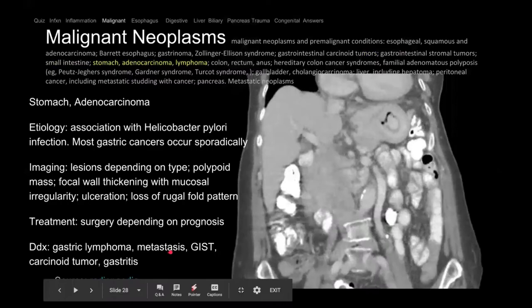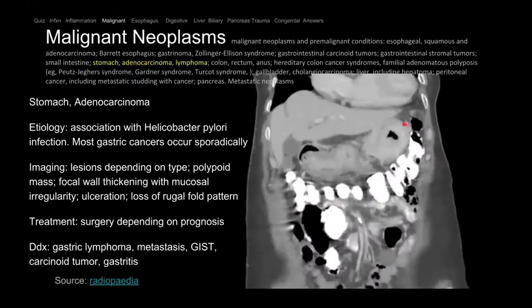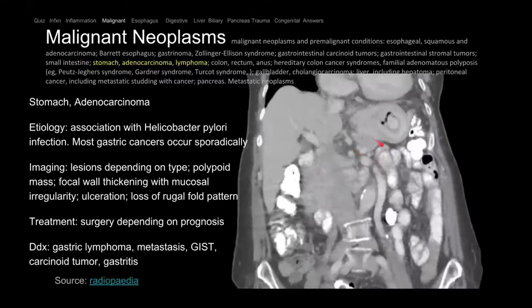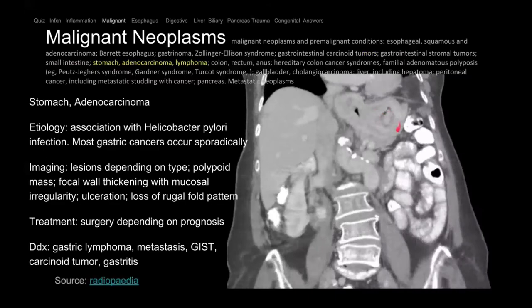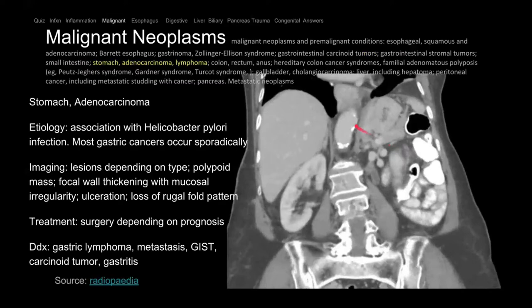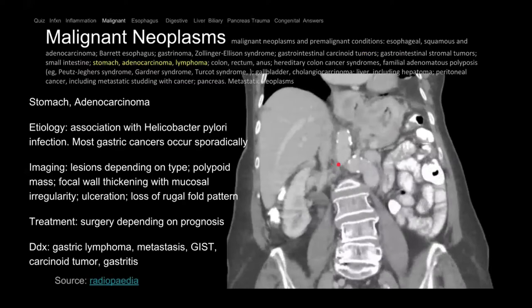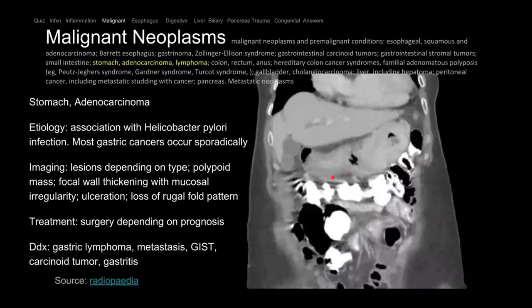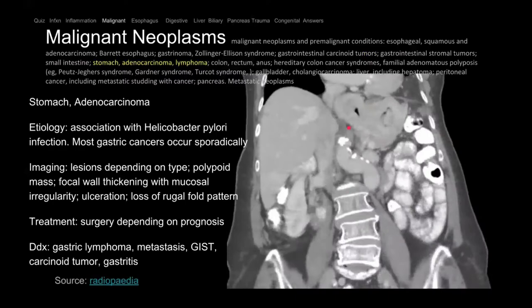Here's a CT abdomen and pelvis coronal. Looking at the stomach — normal stomach has rugal folds, but here we lose the normal rugal folds and it's very thick — an infiltrative process. This is called linitis plastica — infiltrative gastric adenocarcinoma — causing no distension of the stomach. Lymphoma can look very similar, but the difference is lymphoma is a very soft tumor that doesn't cause obstruction, whereas gastric cancer is very hard and causes gastric obstruction. Biopsy is needed to differentiate.